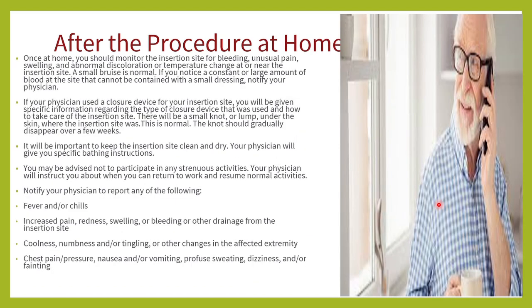After the procedure, at home also, you should monitor the insertion site. Watch for any bleeding, any unusual pain, swelling, abnormal discoloration, etc. A small bruise is normal, but if you are constantly seeing a large amount of blood at the insertion site, then you should notify your physician. And sometimes if your physician has used a closure device for your insertion site, you will be given specific information regarding the type of closure device that was used and how to take care of that insertion site. You have to keep that insertion site clean and dry.